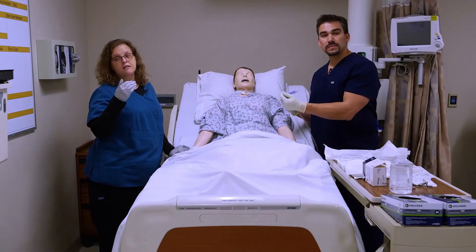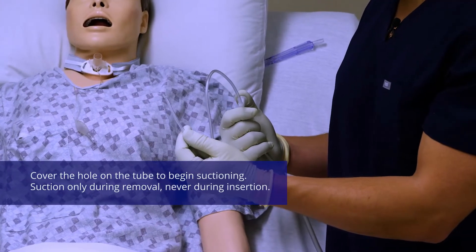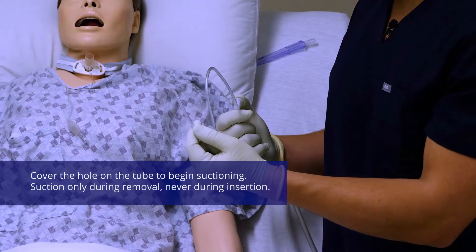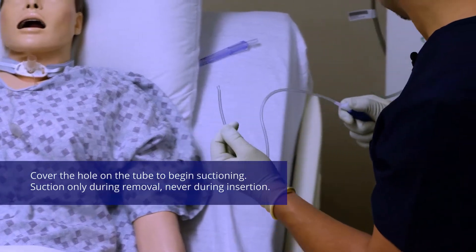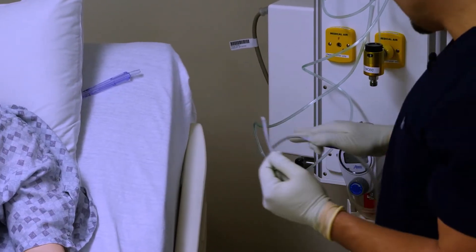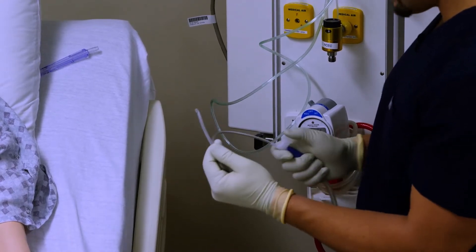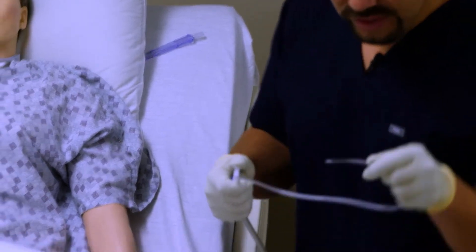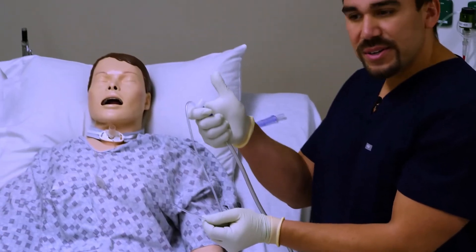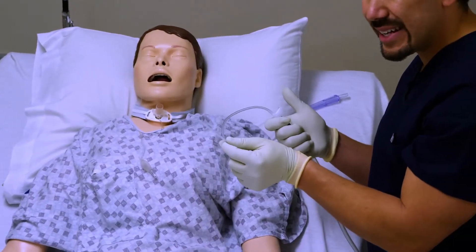You might notice that we've forgotten to turn on the suction. You feel like things have to go in a stepwise motion, but that's just not always reality. Mike can show us how to turn on the suction because we've got a sterile hand and a clean hand. Using the dirty hand and applying good dexterity, make sure we have adequate suction and that it's on. You can even suction some water just to make sure it's working. Make sure not to hold the hole when going in — only coming out — and suction for less than 10 seconds.